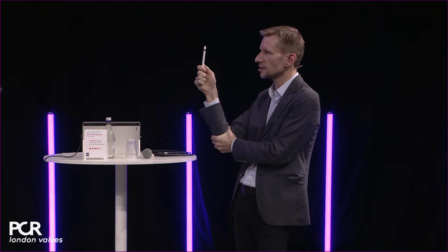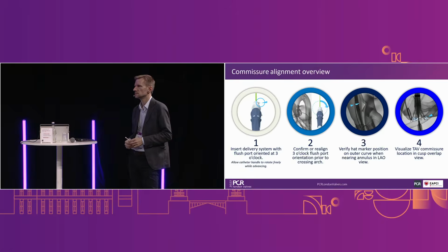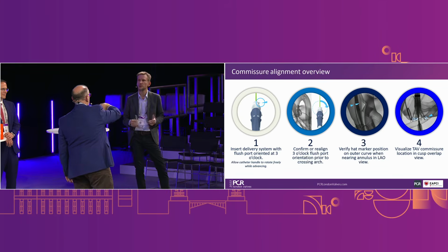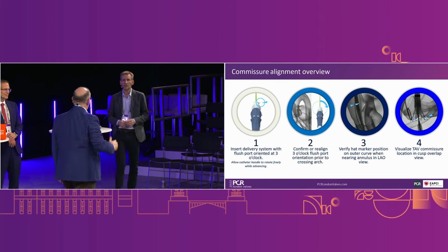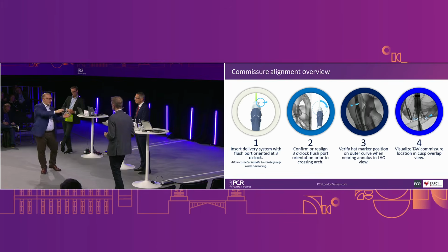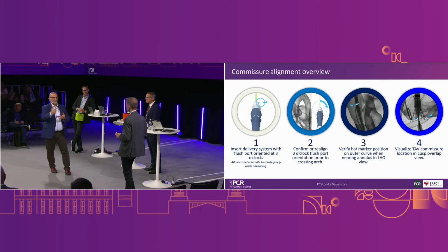You couldn't do it in one direction. Yes? But also, because of the stability layer, so 2 things. I think the drawing is good for the Pro. If you look at the drawing, I would lean a bit more towards the greater curve. Even more. So that's why it negates the need for a Lundequist, because it does what the Lundequist makes you do with the Pro kind of thing.